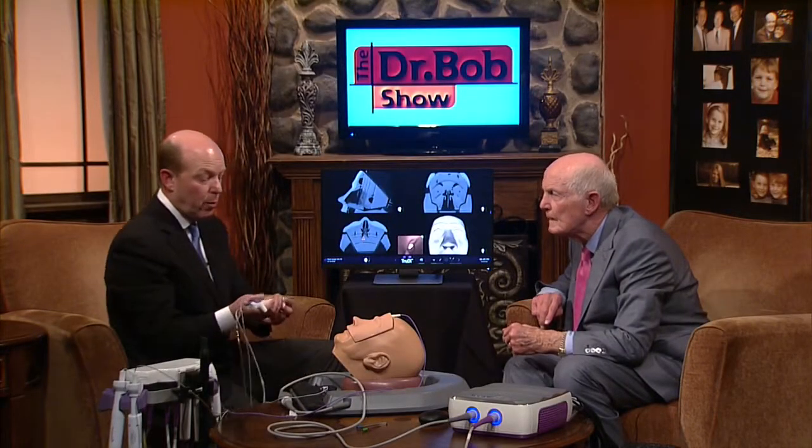So image guidance. So we'll take a CAT scan of someone's head, the same one we've used for diagnostics. Yep, exactly. And then we can use a computer to generate a three-dimensional model, and we can map that person's face and their sinuses with that three-dimensional model. And then in the balloons, the wire that helps us guide into the sinus cavity has a guidance tip on it, like a GPS signal that tells us where the balloon's going to end up.